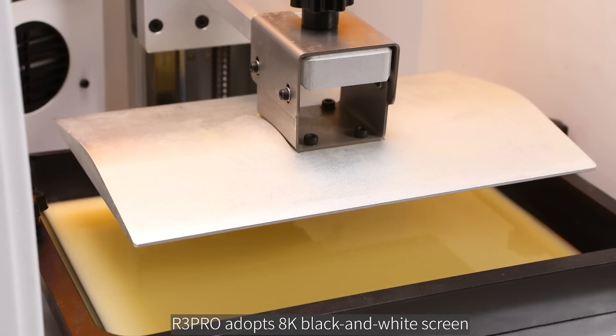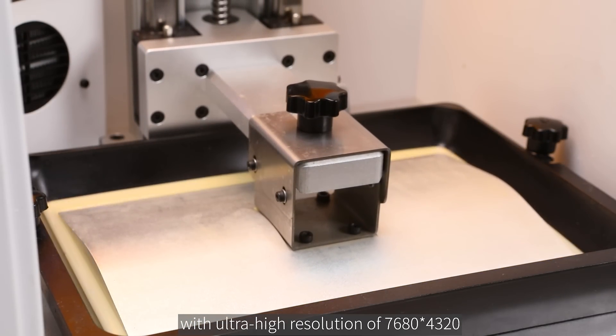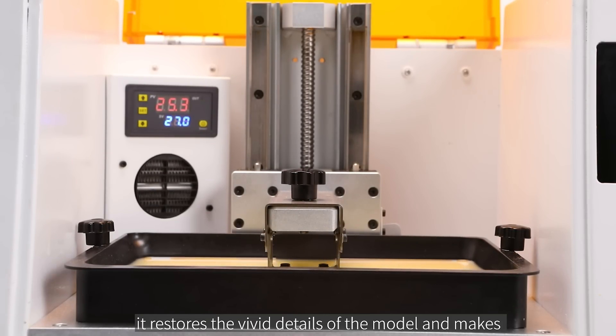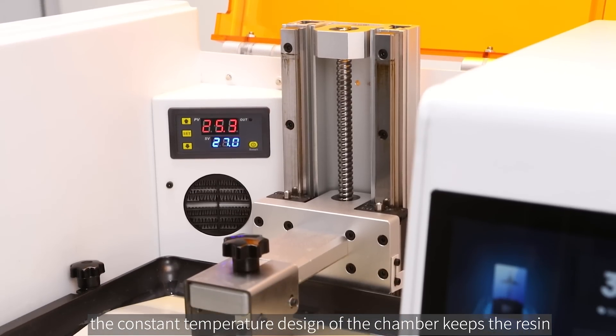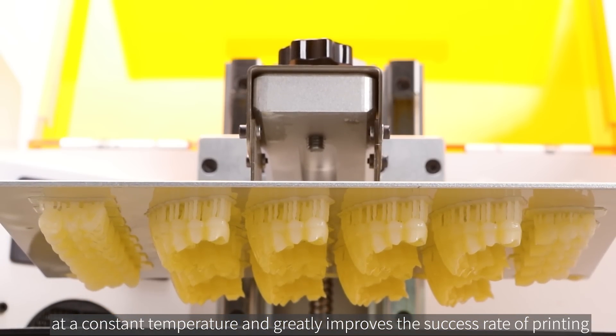The R3PRO adopts an 8K black and white screen with ultra-high resolution of 7680 by 4320. With COB light source technology, it restores the vivid details of the model and makes the model more beautiful in detail. At the same time, the constant temperature design of the chamber keeps the resin at a constant temperature and greatly improves the success rate of printing.